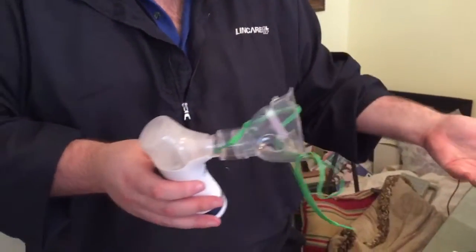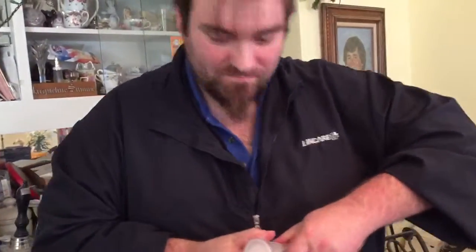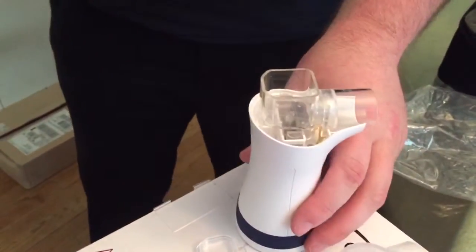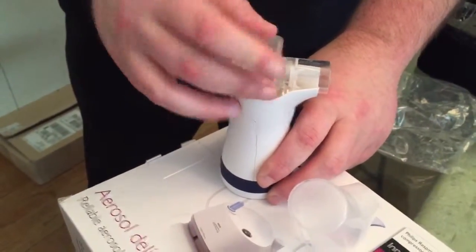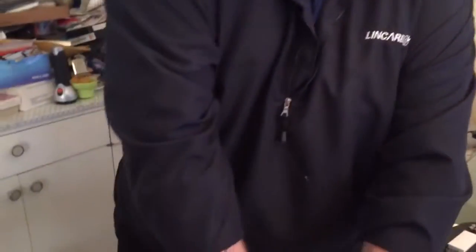Same thing with the big mask, no different. Here's what I thought was the weirdest part: the cleaning. After you've taken a treatment, you open this up, fill it with water, close it up, and let it run until it stops misting. It basically self-cleans and disinfects itself.